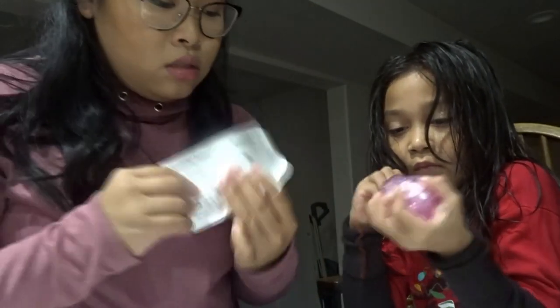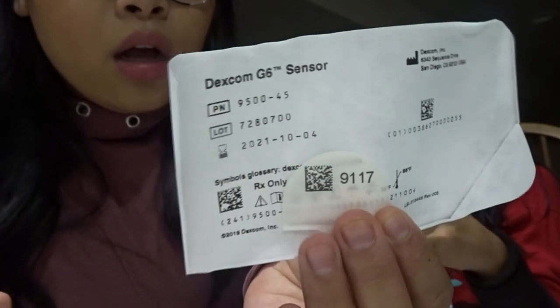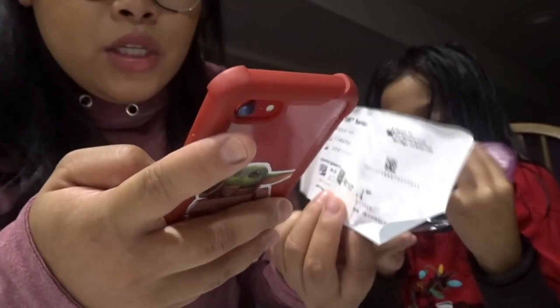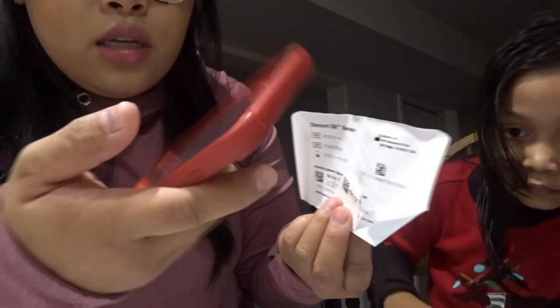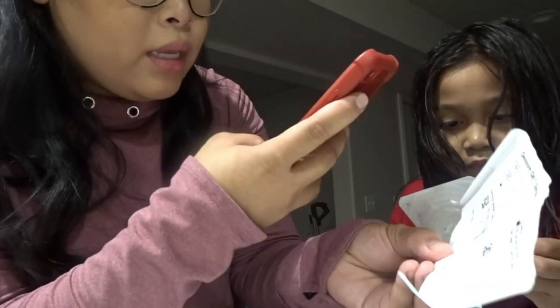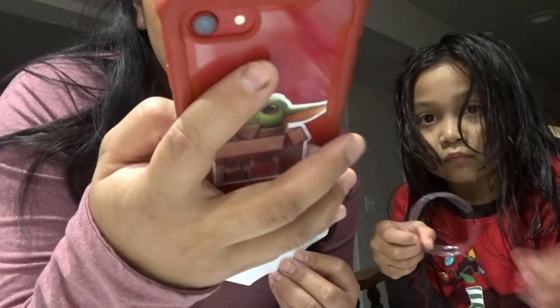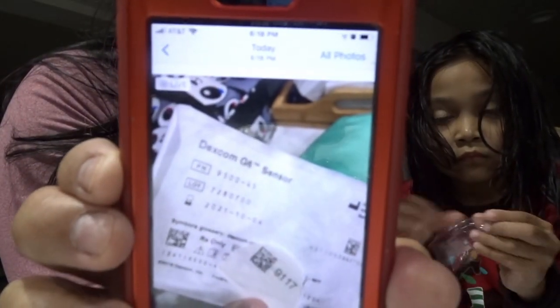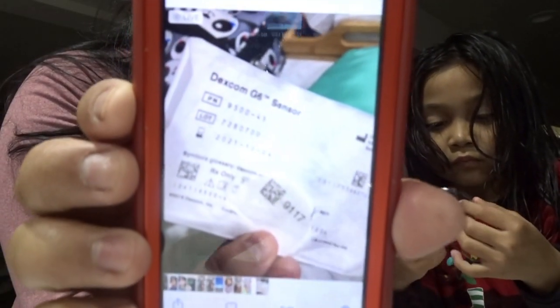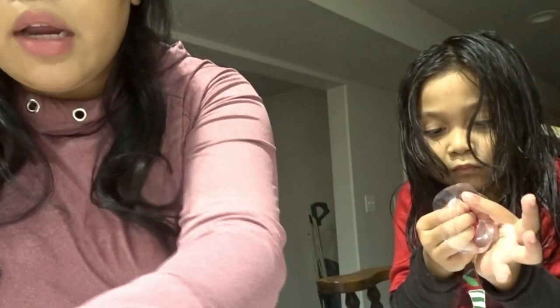Also, you're going to want to take a picture of the code and the lot number on the Dexcom - so if you need to get it replaced, that's what they're going to ask you. Usually what I do with Emma is take a picture with her iPhone, so if they call me it'll be right on her phone with a time and date stamp. That way you don't have to wonder what day you put it on or what day it expired.